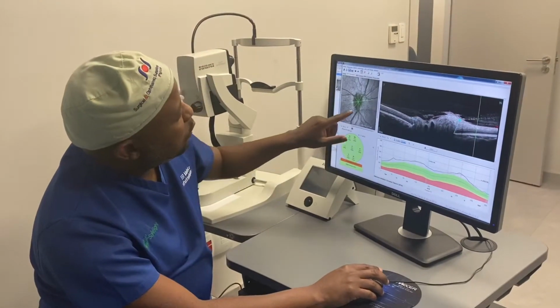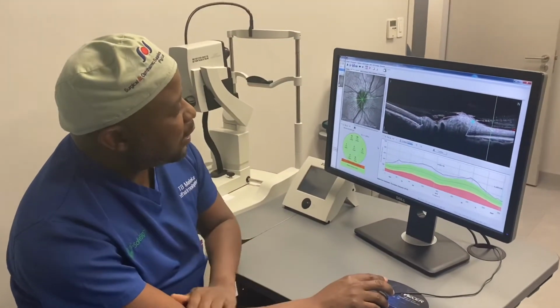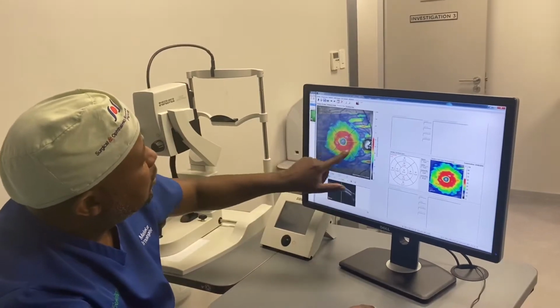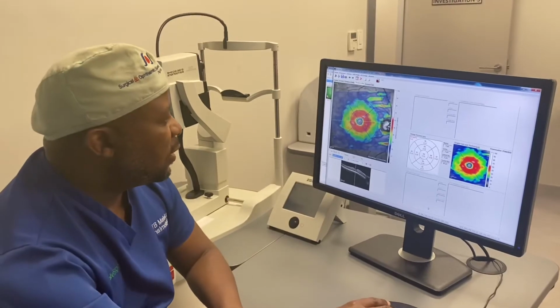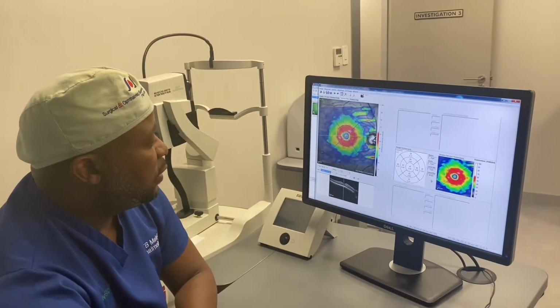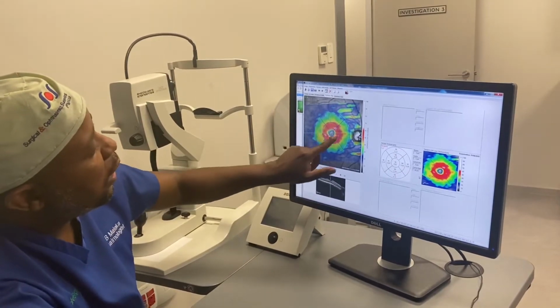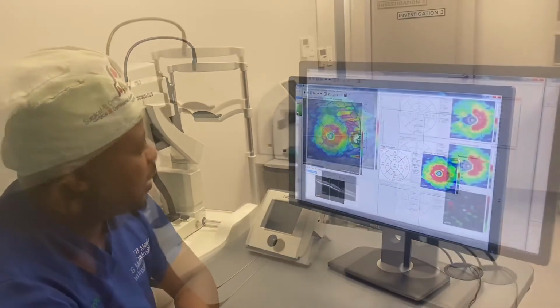With the OCT, you can also take scans through the optic nerve and analyze whether it's healthy. We can also do a ganglion cell analysis on patients, and this is actually a normal ganglion cell. You can also analyze the ganglion cells of a patient, which are the innermost layer of the cells that you find on the retina, and they're quite important. And in a normal scan, you get a complete red donut of these cells, and this represents a normal scan.